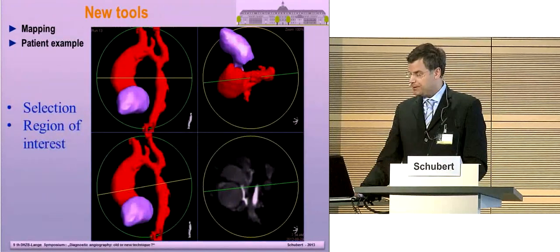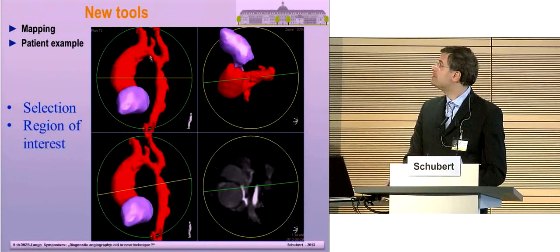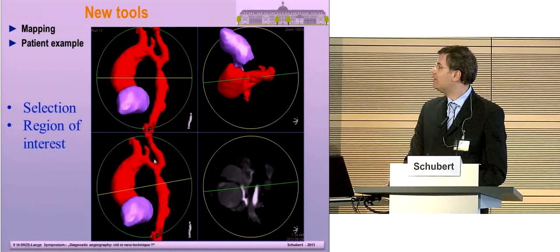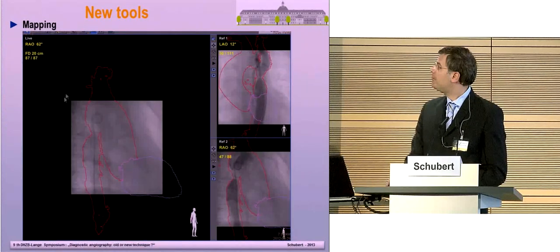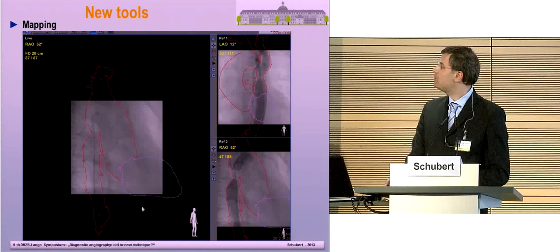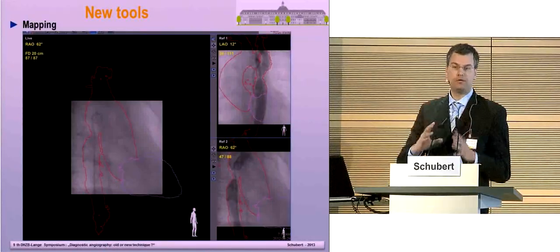And this is a patient where we have done this. It's an isthmic stenosis, as you can see from the MRI data. We have put the MRI data inside our machine, and we can then look. We always have the MRI data underlying here, but with the reconstruction we can look for the narrowing. Then I have a quite circumferential picture in my angio, and I can put this together and overlay the MRI data in my fluoroscopy.